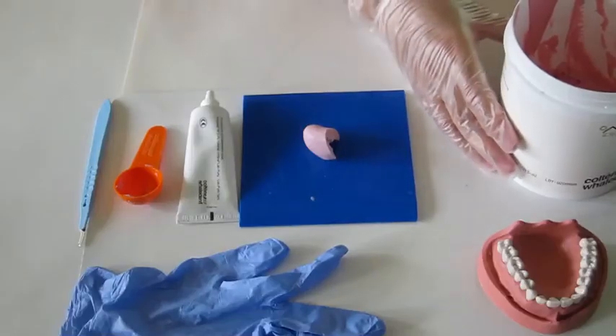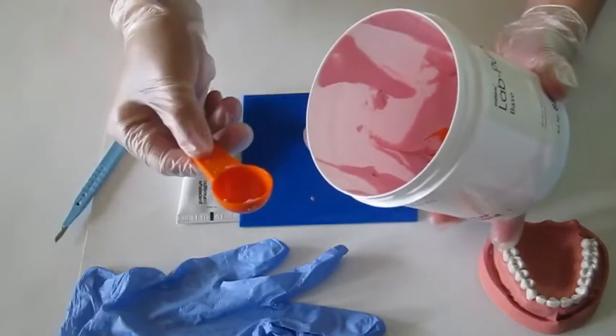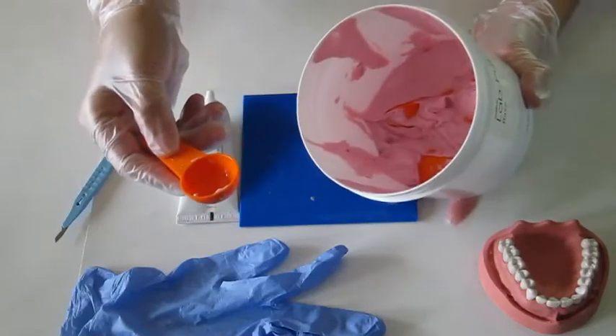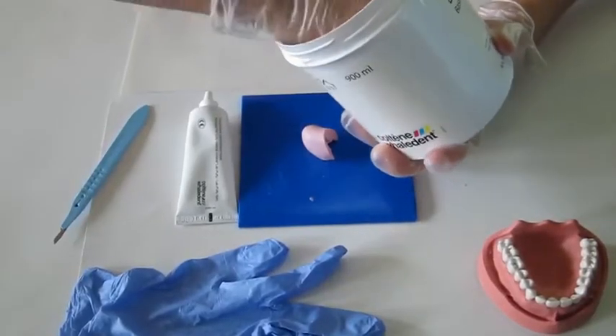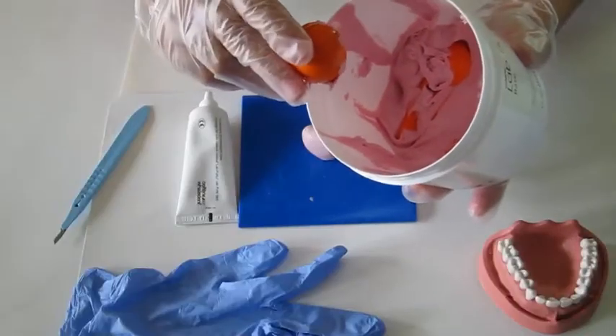Next, I will talk about the dosage of the material. We need one scoop of putty for today's practice. So just measure out the base from the box and take off the excess.